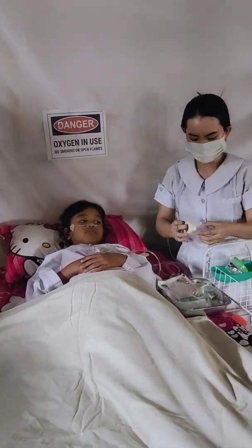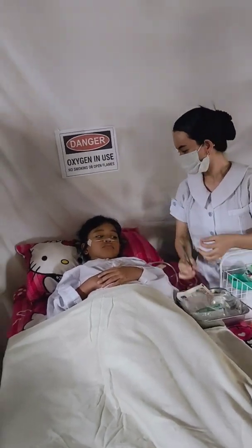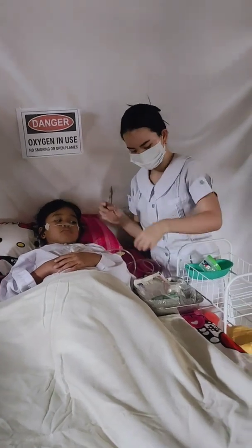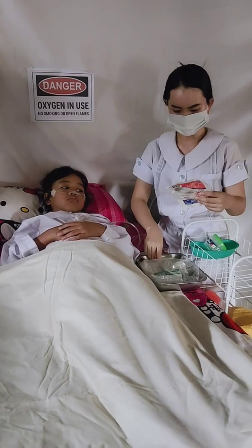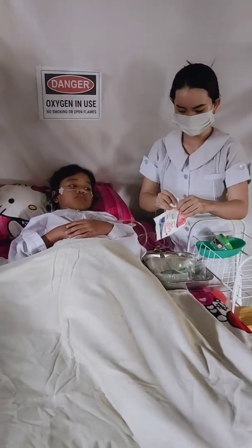And then, pad the tubing over the ears and cheekbones as needed. This is to keep the skin from getting sore. Then last is encourage the patient to breathe through the nose with the mouth closed so that the patient consumes the oxygen needed to sustain normal body functioning.